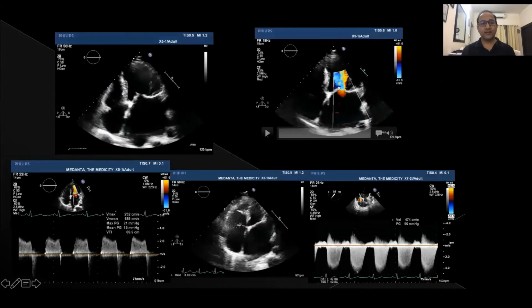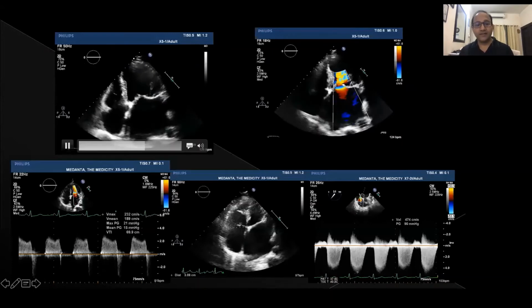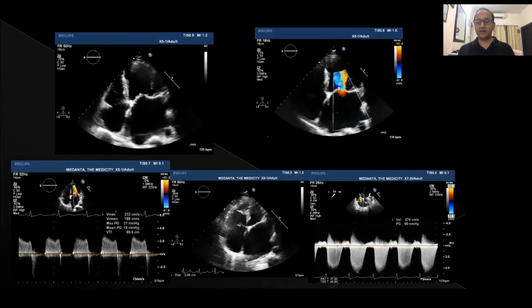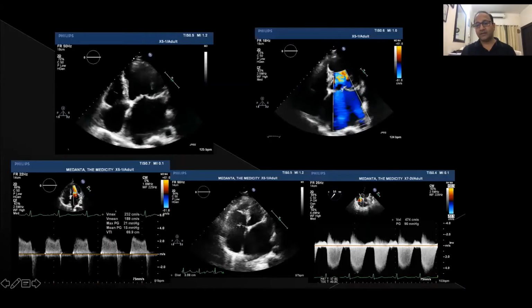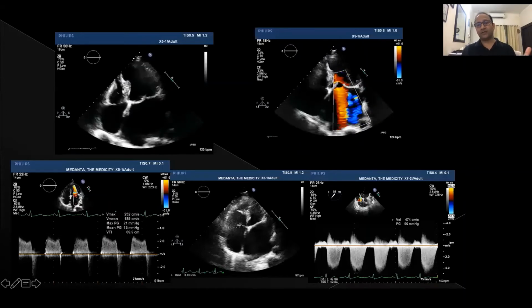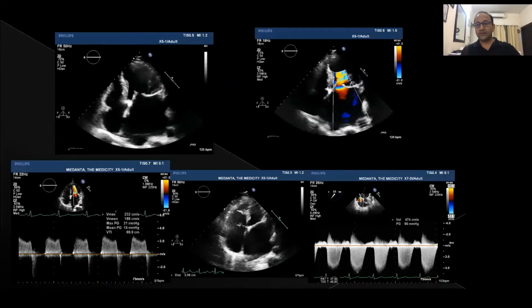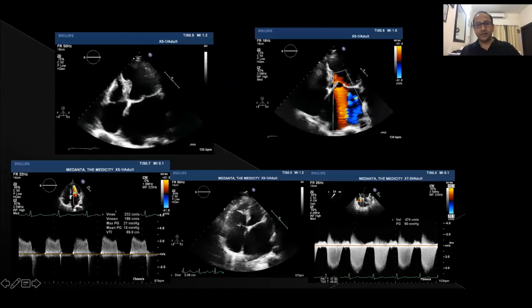Now, you can see the severe mitral regurgitation in 4-chamber view. Look at the gradients. Gradient is 15, okay? But the mitral valve area was nearly 1.8 centimeters square. So this is one way where you could introduce discrepancy in gradient versus the mitral valve area. Here, look at the PA pressures being close to 80 or so, 80, 90. And if you add RA pressure, of course, it will be somewhere around 100. And these tell you this is mainly because of the LV dysfunction and mitral regurgitation.